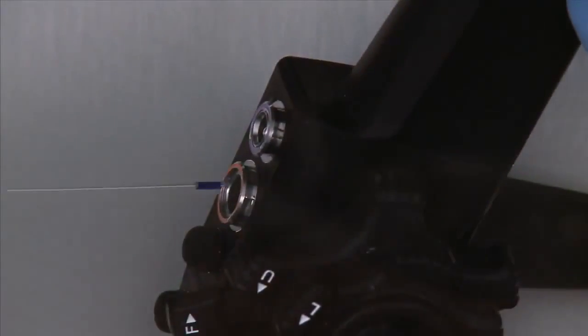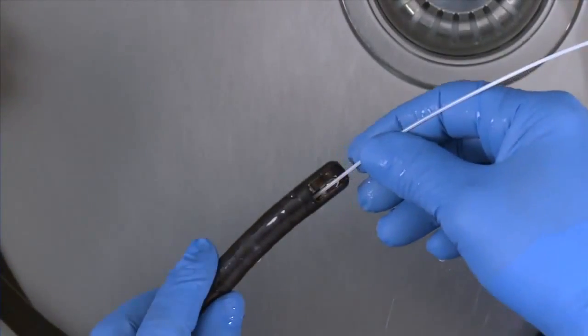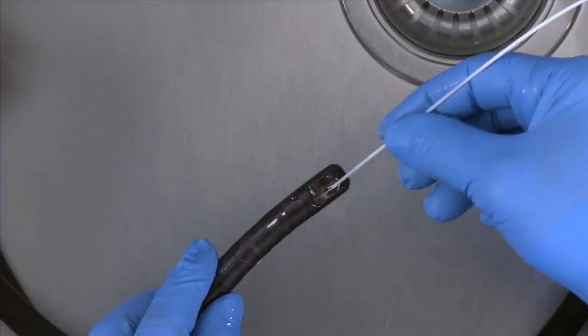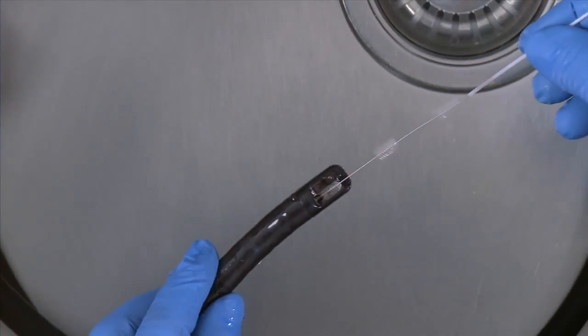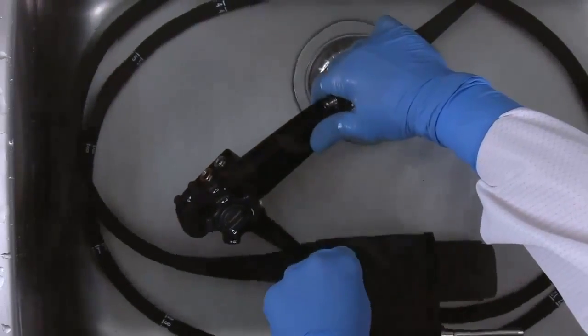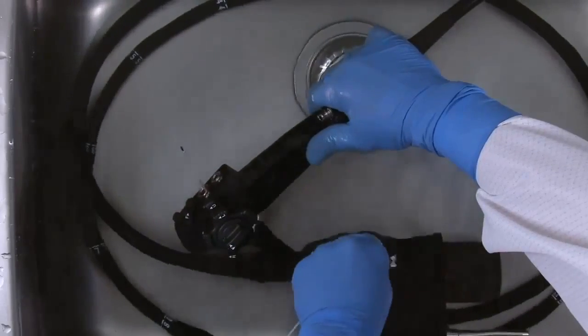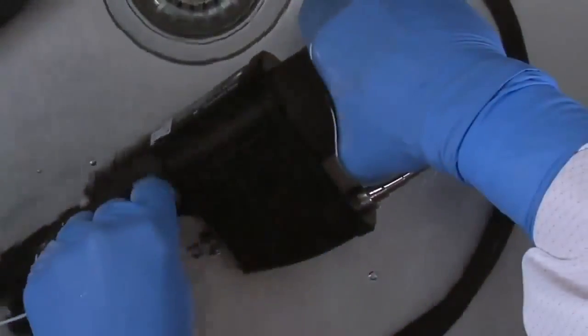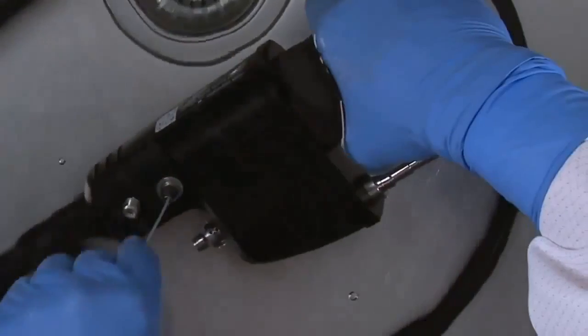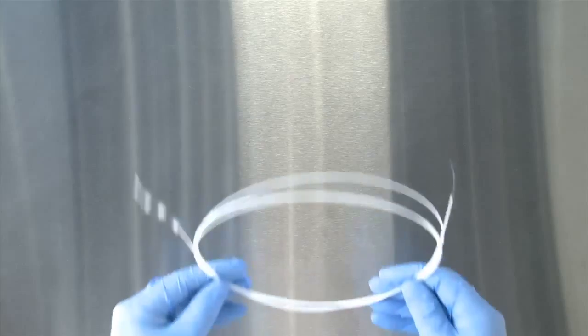Pass the same brush through the hole in the bottom of the suction cylinder on the control body at least 2 more times or until the bristles emerge from the distal end of the insertion tube visibly clean. If the biopsy channel is kinked or resistance is encountered at any point, do not apply force to insert or remove the brush. Send your endoscope into PENTAX for repair in order to avoid potential damage. Remember that disposable brushes should only be used once.